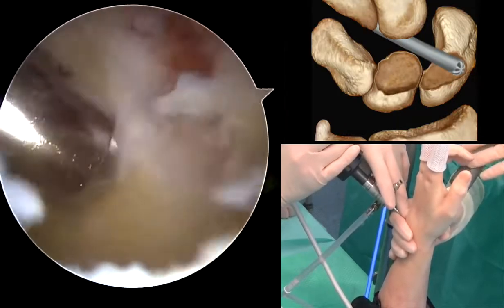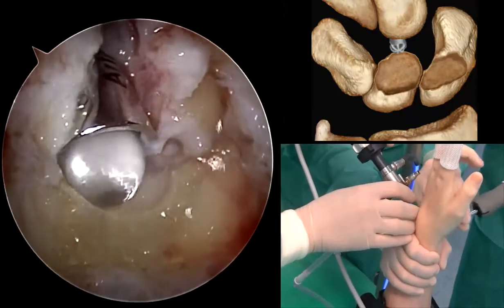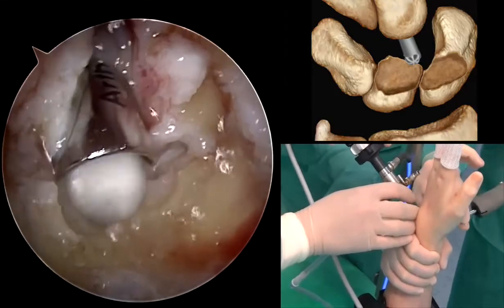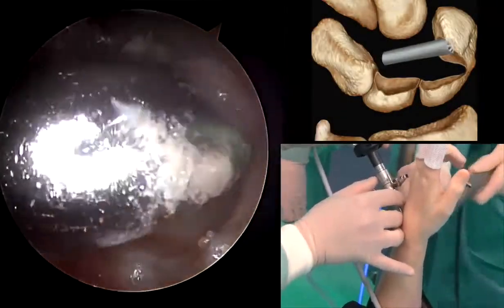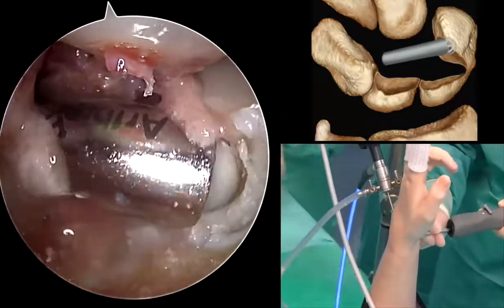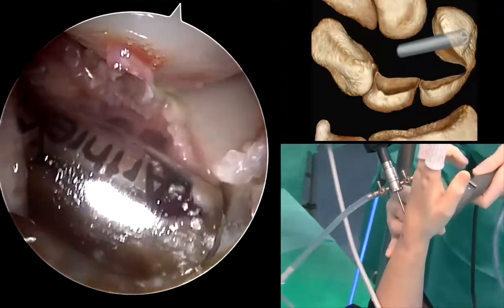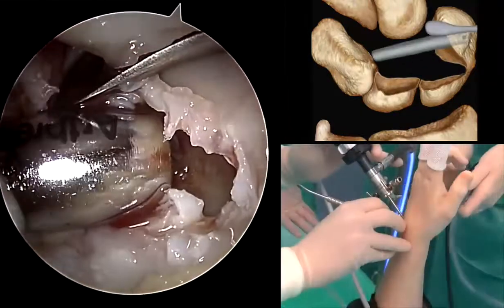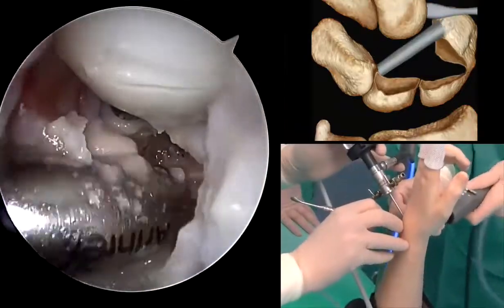The next portion of the bones to be removed is the volar and proximal portion of the scaphoid. The 4 mm burr is used to remove the inner portion of the bone, leaving the peripheral cartilage as if it were an eggshell. This way is less probable to damage the cartilage of the capitate. Furthermore, a periostotome entering from dorsal can be used to protect the surface of the capitate.